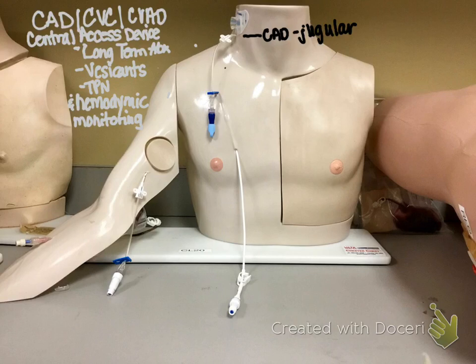So the first one up here is the jugular, and as you can see, there's one lumen, but hardly ever do you see just one. I mean, you will, but most of the time there are several lumens, like 2, 3, 4 even, and it goes right there in the neck. And these lumens hang. You will often see a cap on the end that is a decreased infection cap that will be filled with alcohol or chlorhexidine. Those caps are amazing because they have been shown to decrease the risk of infection for the patient.